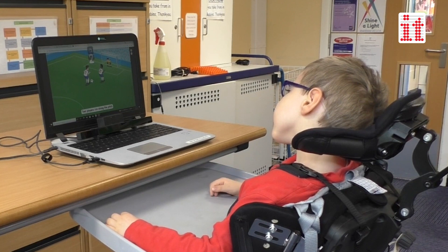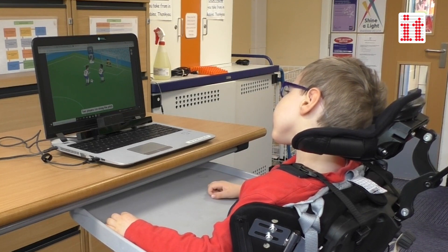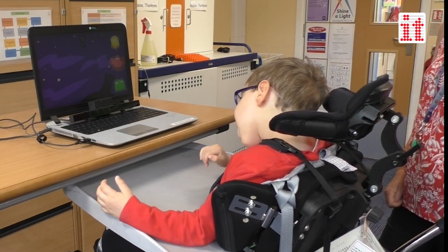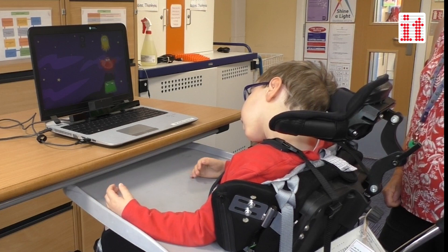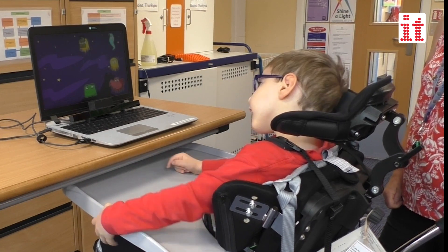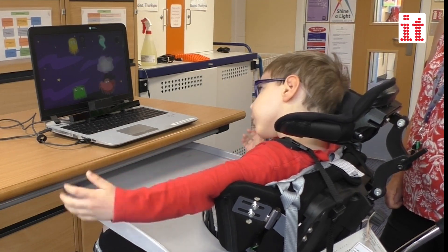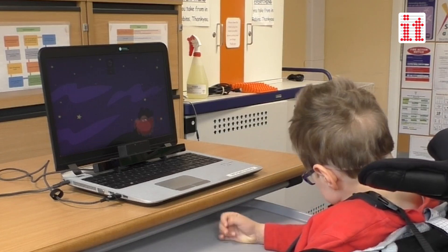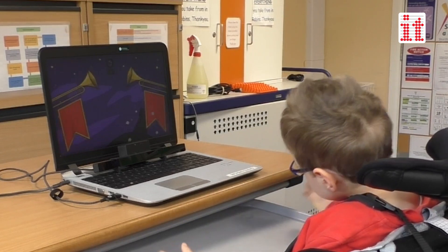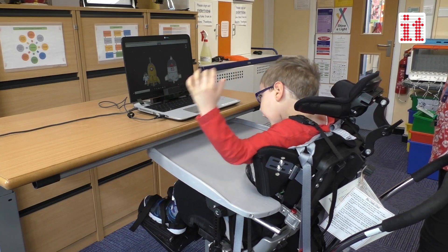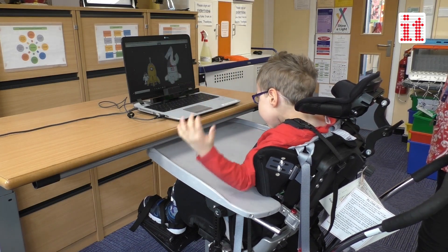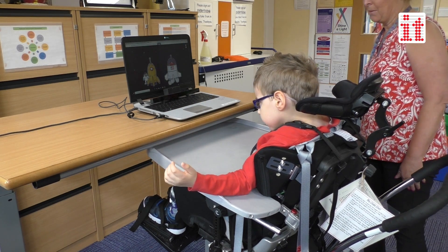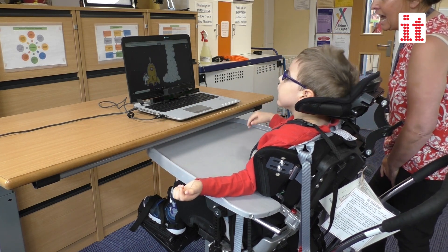With Skyl for Windows, learners can play, learn and participate in classroom activities and develop their eye gaze skills at their own pace. An ideal solution for learners with severe and complex needs and learning difficulties, Skyl for Windows is suitable for users with a wide range of special educational needs.